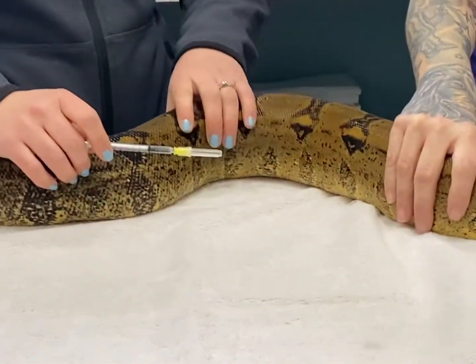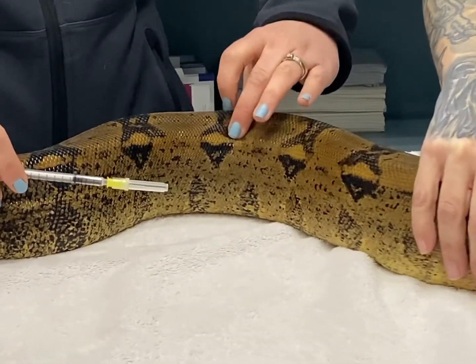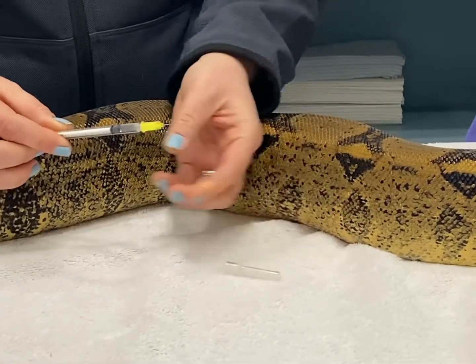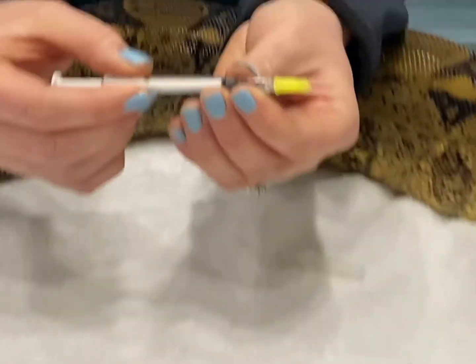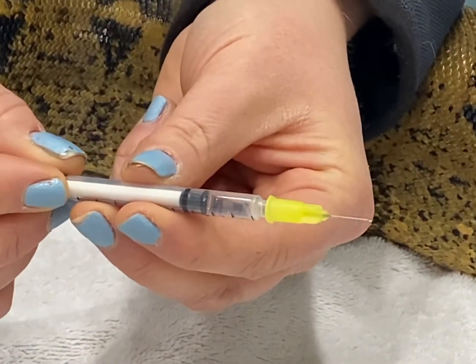Once you're in that middle third, you want to find the spine — you can easily feel that spine on him — and then on either side you're going to feel that nice soft muscle. So you uncap your needle. When you look at your needle, there's what's called a bevel. That's where the little hole is on the needle, and you want that to be up when you're doing your injection.